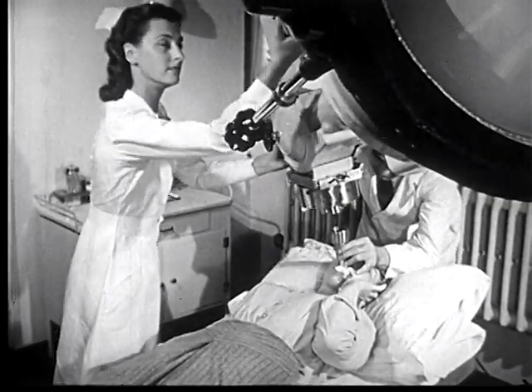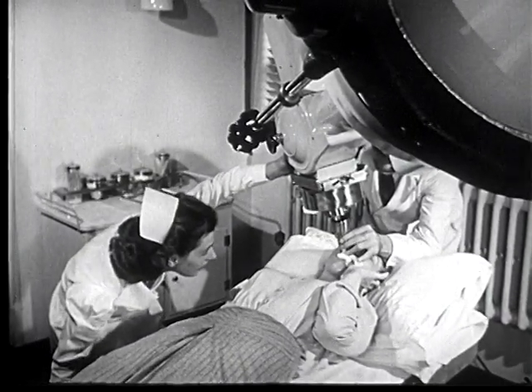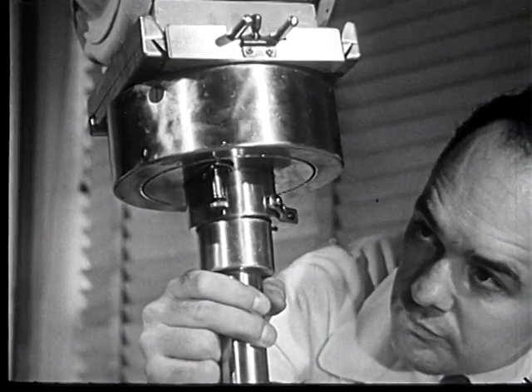The doctor holds the cone in place as the technician slowly and carefully raises the table until the cone can be connected to the X-ray machine.